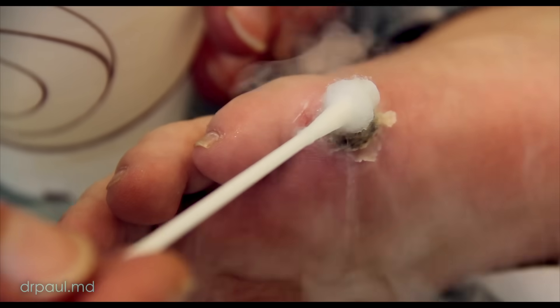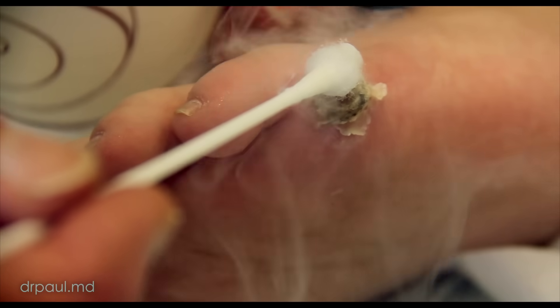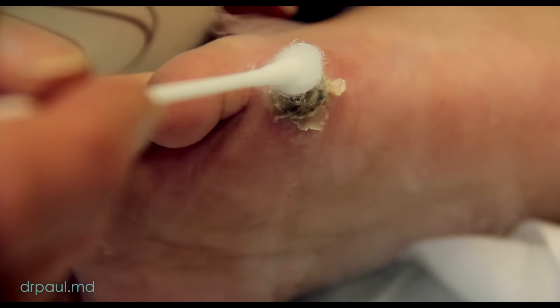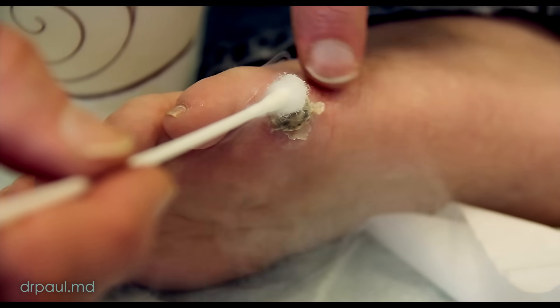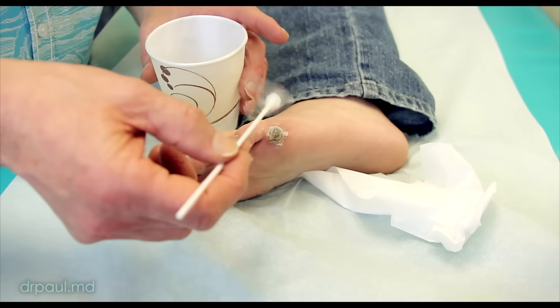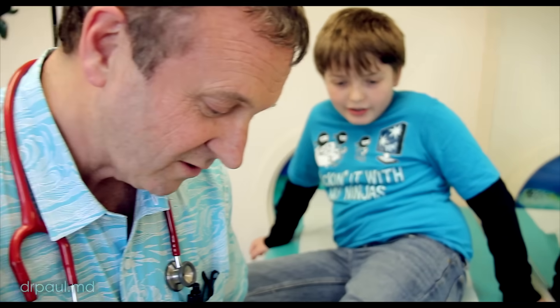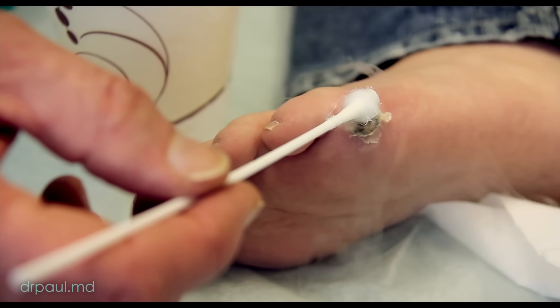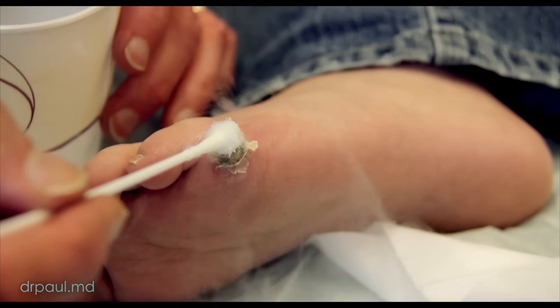I don't think you're going to feel anything at first. You feeling anything yet? No. I don't know why, but my eyes are watering — just the thought of it probably. So what the liquid nitrogen does is it's so cold that it freezes the entire wart, which is a virus. Our goal is to freeze deep enough that we get a little bit of normal tissue, because your normal skin — like you can see the red skin around your wart — that has blood flow. And if we can get your red skin irritated, it brings more blood flow. It's freezing but it's not stinging like I remember. So we're going to freeze some of your normal skin — it's frozen white like an ice cube. And then when it thaws, blood rushes into the area and your immune system actually interacts with the virus that's there. It's like the feeling you feel on your face when you fall into thick snow, times 10.